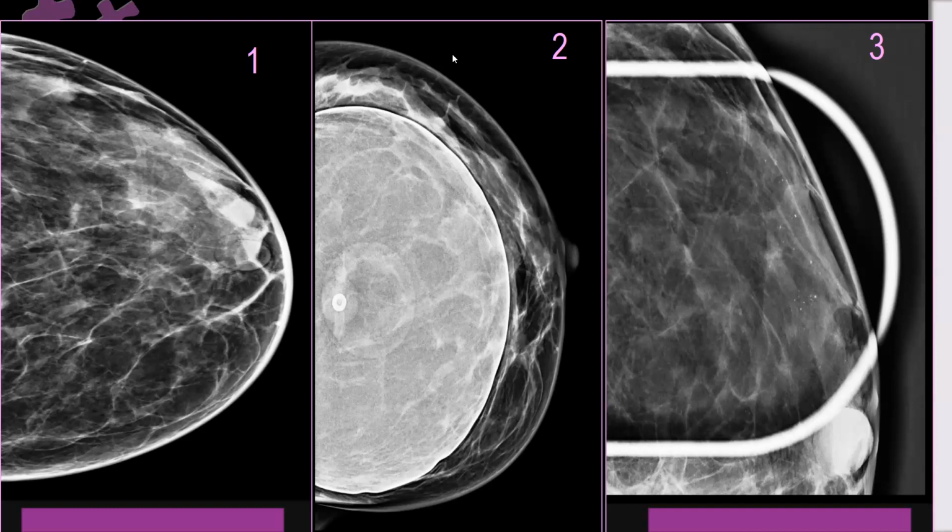Saline implant. Excellent. Why is it a saline implant? Saline implants are not much denser. Yeah, the density, it is relatively less dense. You can see through it, and you can see something here. What is this? I think this is a hole. The port? Port, yeah. That is a port. So this is a saline implant.